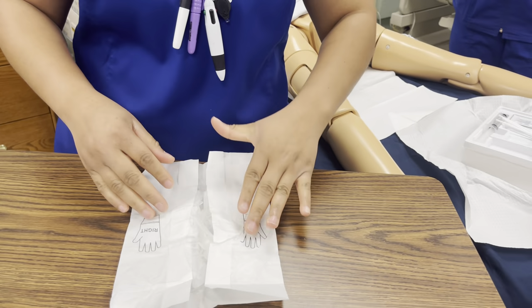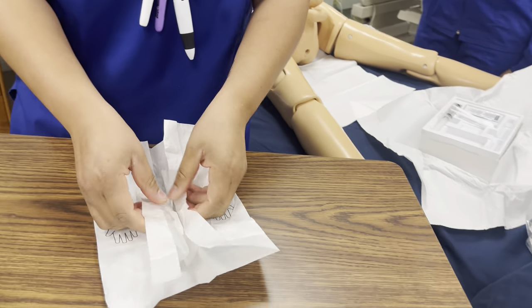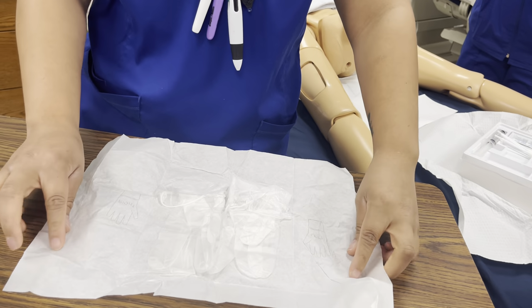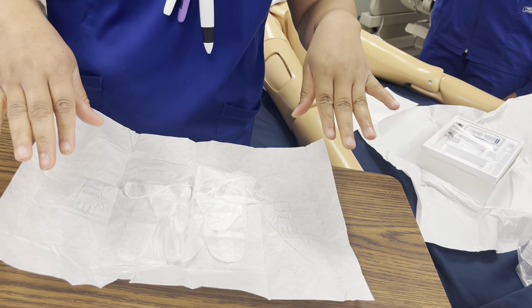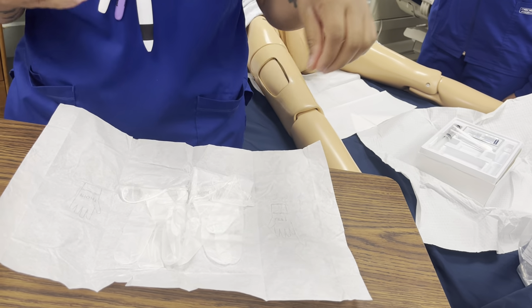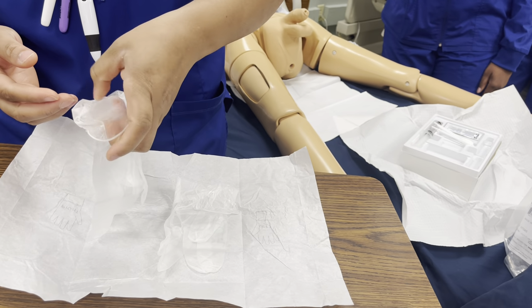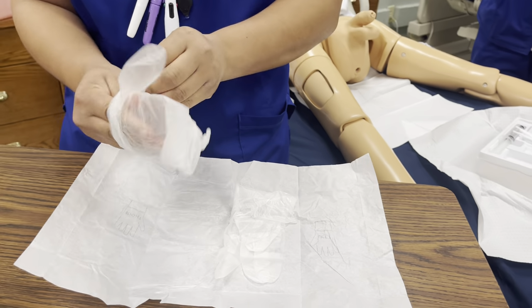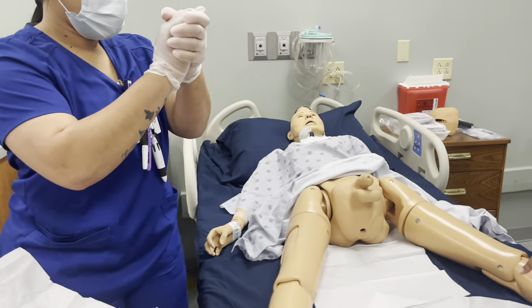We've got our catheter tube loose. We're going to wrinkle it out, y'all. I'm going to make sure you don't break sterilization. Open up the basket, wrinkle it out, and then I'm going to put on my dominant hand glove. I'm going to take it like this. I just flipped the mess over there. All in. Now I'm sterile.